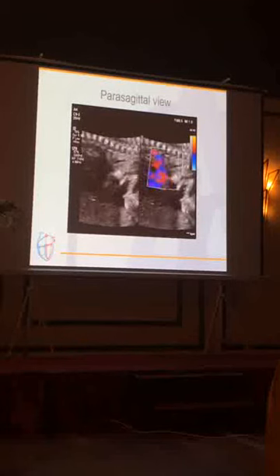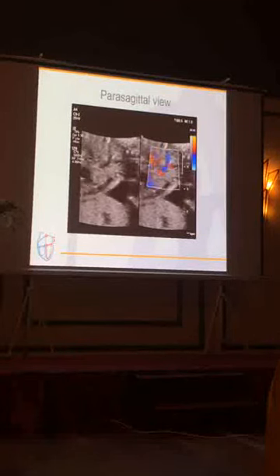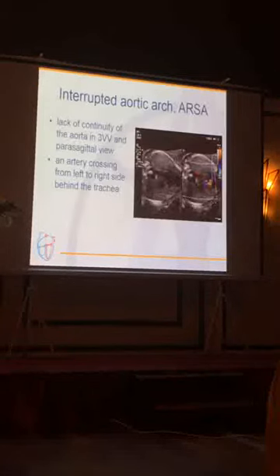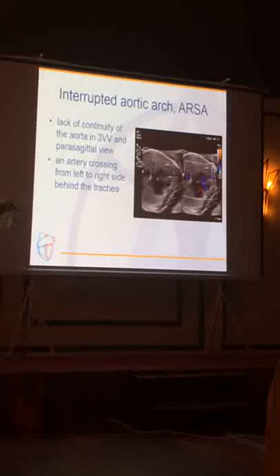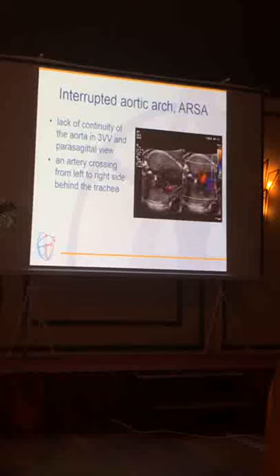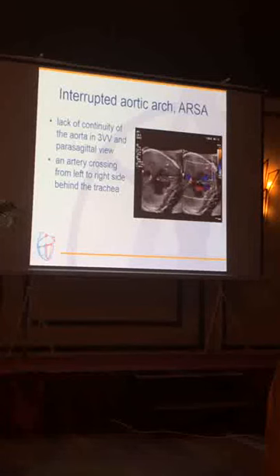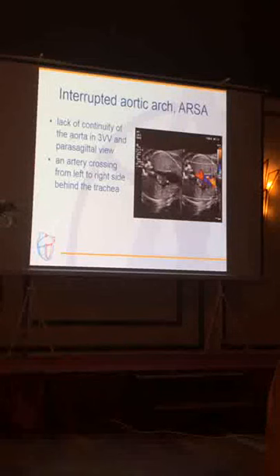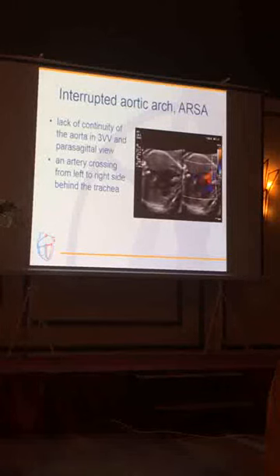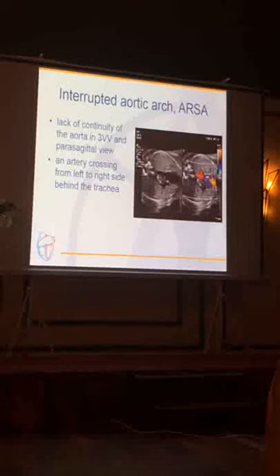As you are mostly obstetricians, the one feature we are looking at in cases like this is the presence or absence of the thymus, and look how close the vessels are to the anterior chest wall, so the thymus could be hypoplastic in this case. And in the heart, what's visible quite often is this ventricular septal defect, and this is very, very special.